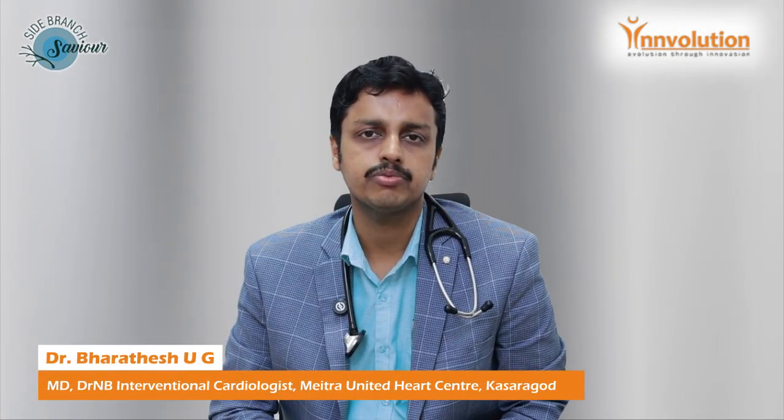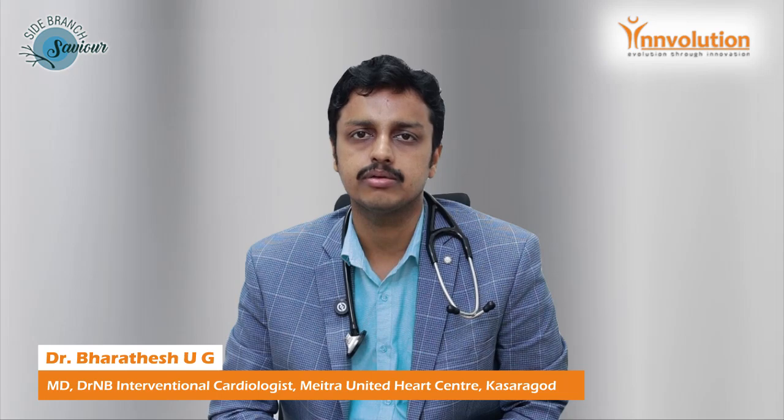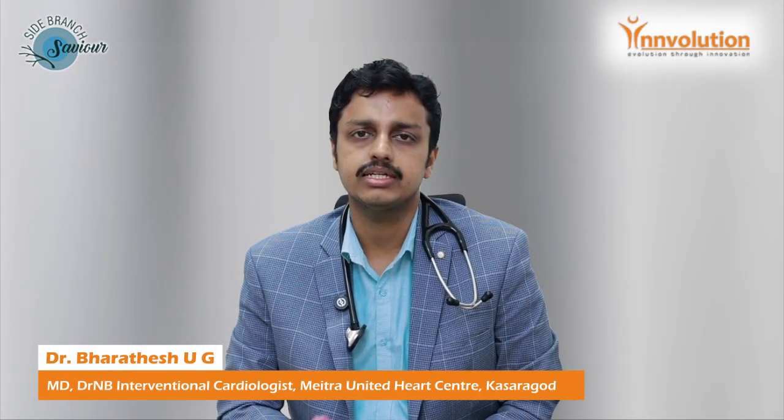When you do a left main bifurcation, optimal post dilatation is done by the kissing technique, using a two balloon technique, and along with that you have to do a POT. This helps in preventing restenosis and giving a good result to the patient. I would prefer to use an open cell design with good expansion capacity as a side branch savior.